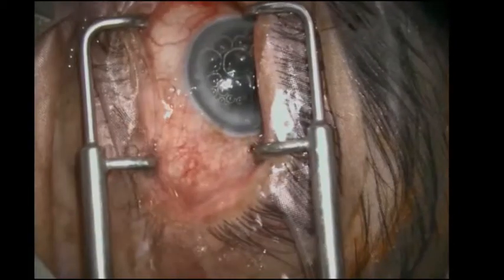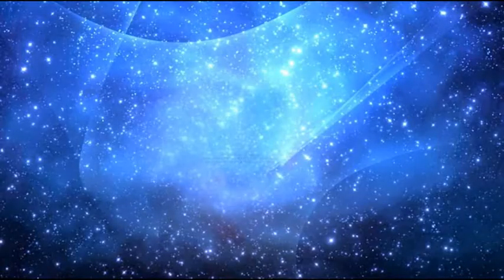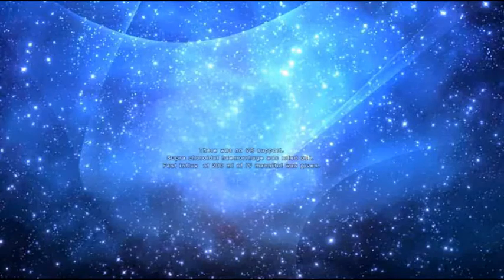Once the AC was deepened, the speculum was removed. There was no VR support. Suprachoroidal hemorrhage was ruled out.